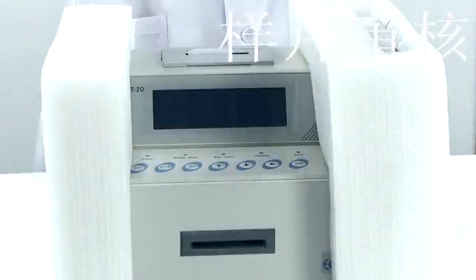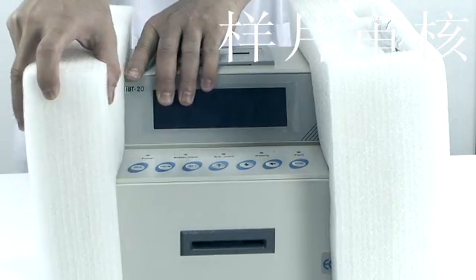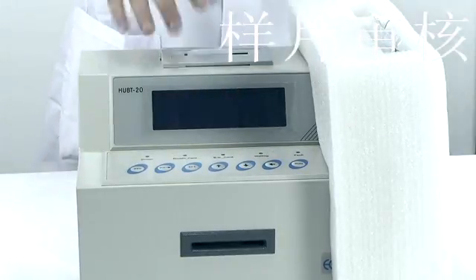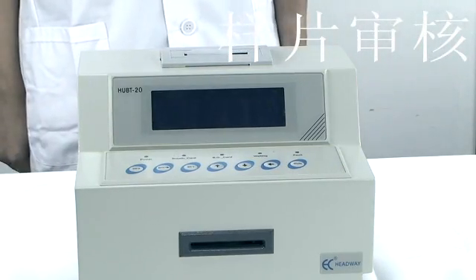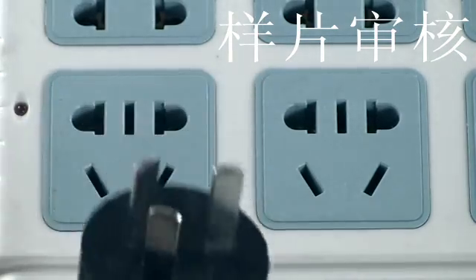Move the device to the installation platform. Check again whether the device was damaged during transportation. Check the accessories according to the instruction manual and make sure all documentation and accessories are complete and in good condition. Then move the device to the working platform.